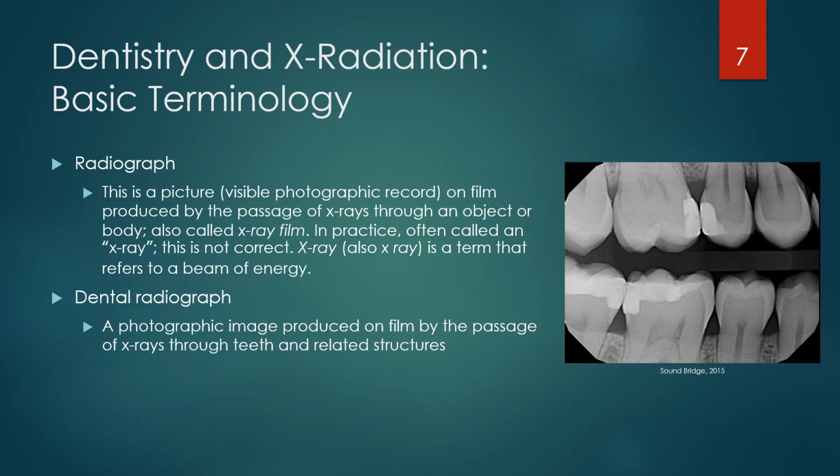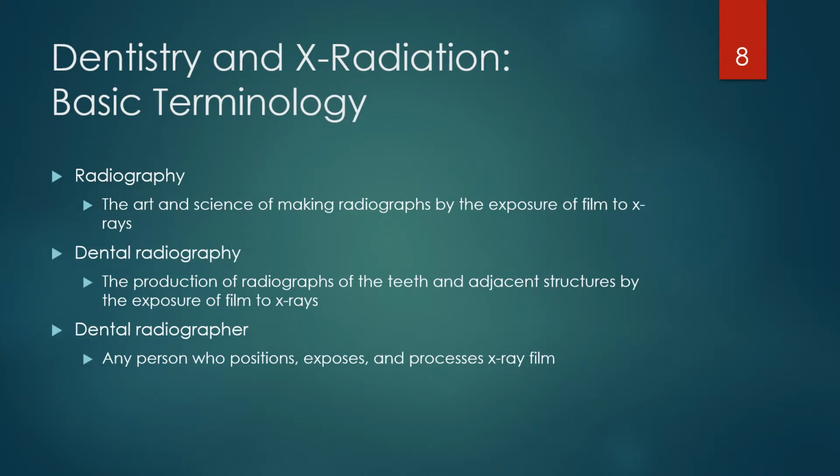A dental radiograph, I'm sure you can connect the dots here, is a photographic image produced on film by the passage of X-rays, but only here it has to go through teeth and related structures. Radiography is the art and science of making radiographs by the exposure of film to X-rays. I've never really considered myself an artist because I take radiographs, but I guess I am. I'm an artist taking these radiographs.